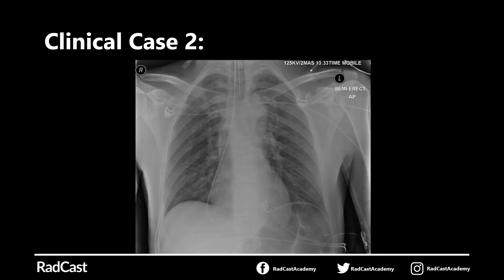So, this is the case, and as you can see, by far the most important thing going on here is that the nasogastric tube has been wrongly inserted into the patient's airway. It travels down the trachea and then goes down the right main bronchus into the right lung base where the tip is located. It's really important that this is removed immediately, because if any food or medication is passed down this nasogastric tube, the patient is going to get a lower respiratory tract infection and get sick and possibly die.